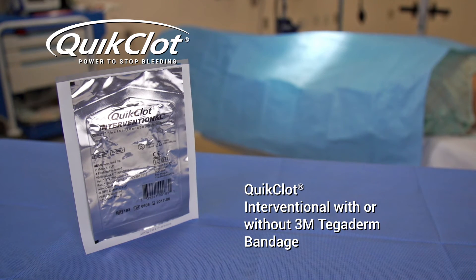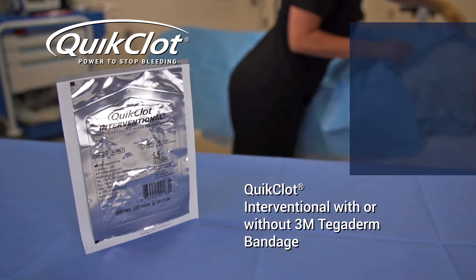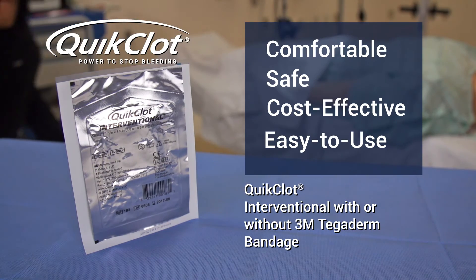As you can see, from application to hemostasis to removal, QuickClot Interventional is a comfortable, safe, cost-effective, and easy-to-use device for diagnostic and interventional procedures.